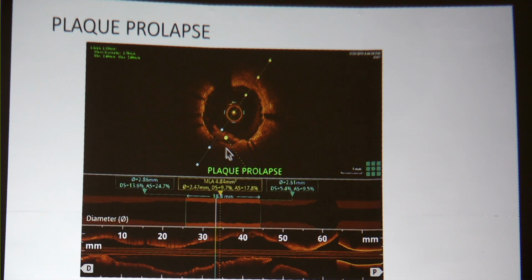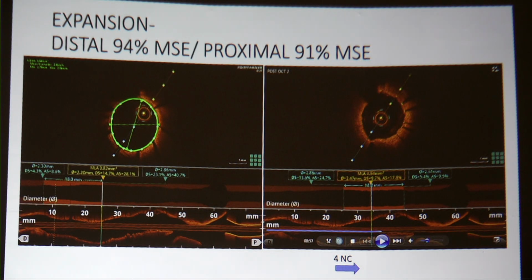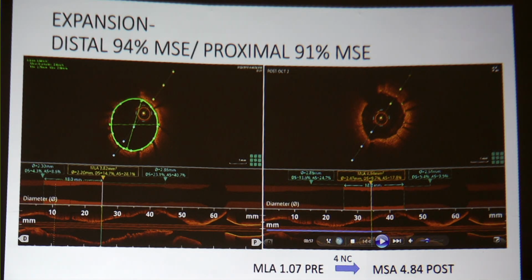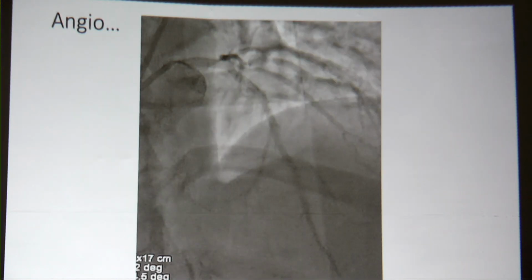And then if it is more and TIMI 3 flow is not achieved, probably you'll have to treat it, otherwise you can just leave it like that. And basically, we get a good expansion in such cases also. And this is one of our routine, normal ways you treat an acute MI in your routine practice. Now look at this angiogram.